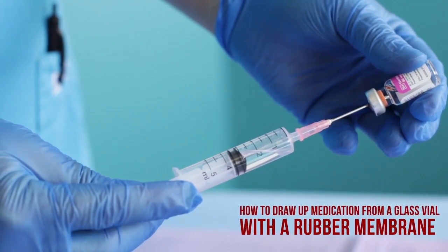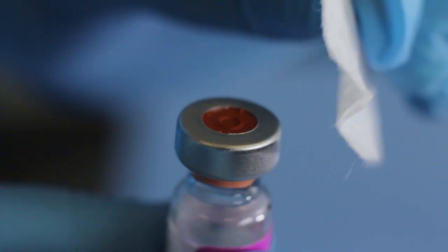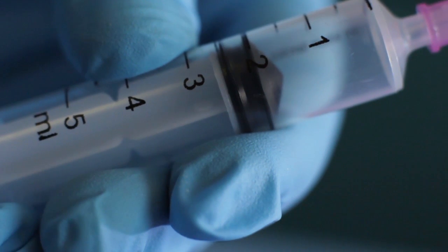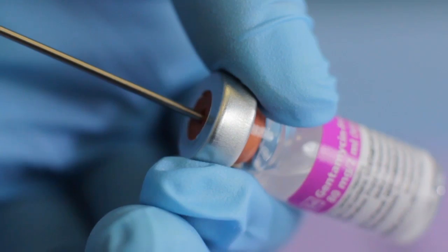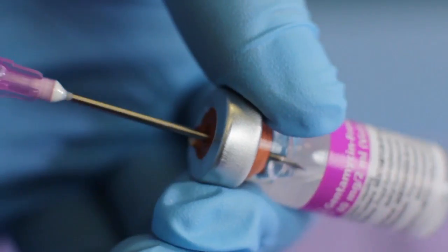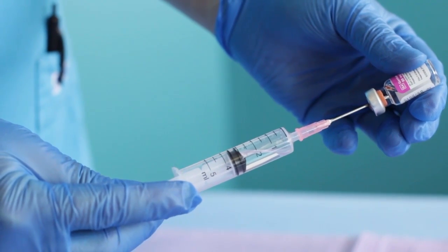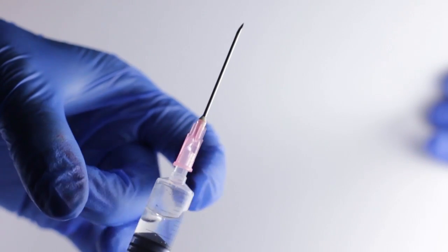How to draw up medication from a glass vial with a rubber membrane. Note that this type of vial is not supplied in your kit. Carefully remove the protective cap from the vial and swab the top of the vial thoroughly with a fresh alcohol wipe, allowing time to dry. Determine the volume of medication required in milliliters, then draw in an equal amount of air by pulling back on the syringe plunger. Carefully remove the needle cap from the syringe or remove the protective cover from the safety syringe. Insert the needle into the center of the rubber membrane of the vial. Turn the vial upside down and slowly inject the air from the syringe into the vial of medication. Gently pull the plunger, allowing the medication to fill the syringe, and withdraw the required amount of medication as specified. Withdraw the needle from the vial and get rid of any air bubbles in the syringe. Prepare to administer the medication using the appropriate route.